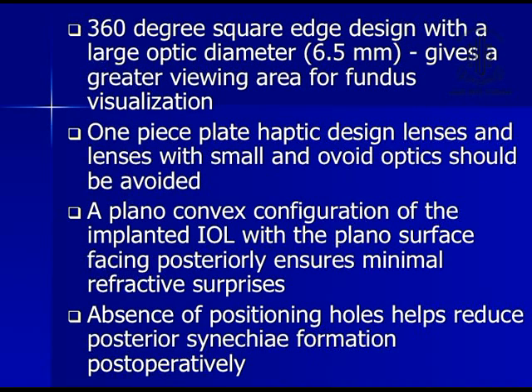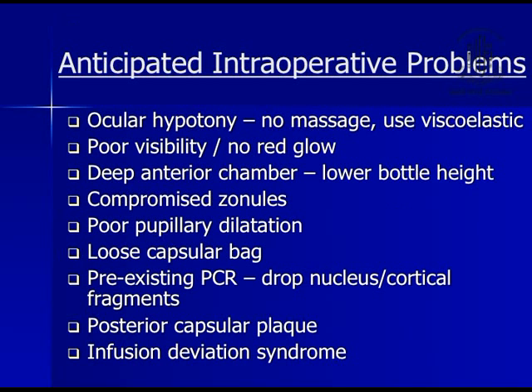A 360-degree squarish design with large optic diameter gives greater viewing area for fundus examination. Small and ovoid optic lenses should be avoided. A plano-convex configuration of the implanted IOL with the plane surface facing posteriorly ensures minimal refractive surprises, and absence of holes is again helpful.